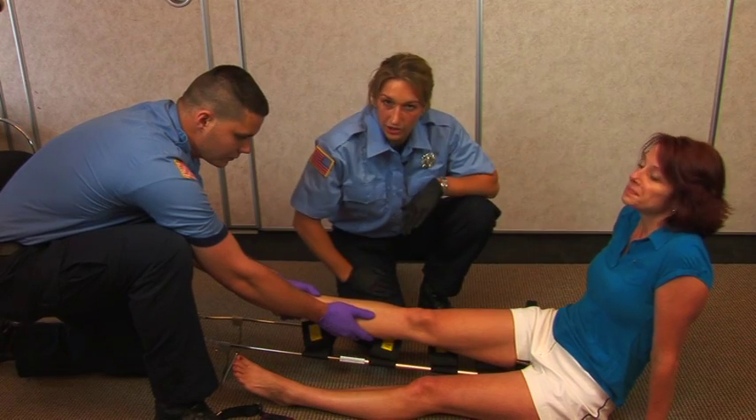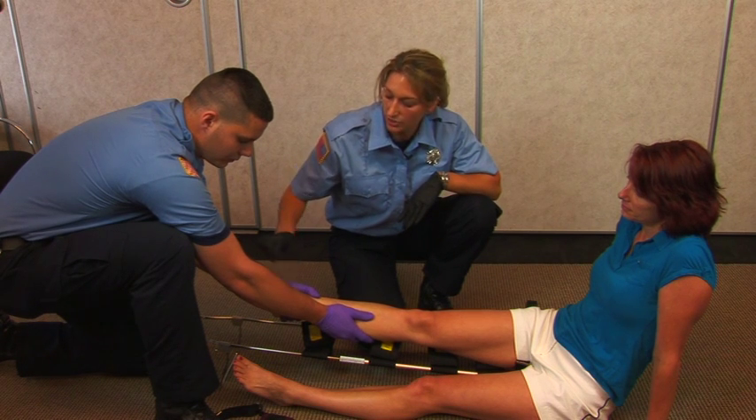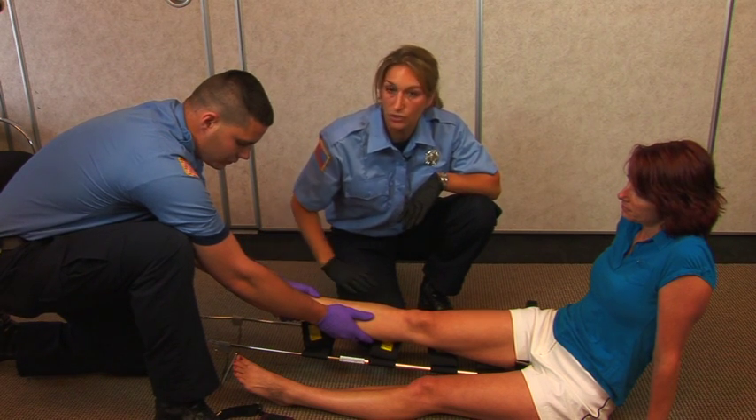Before you apply the traction splint, you want to make sure that you check for pulses in the foot, that the patient can feel you, and that they can also move their toes.